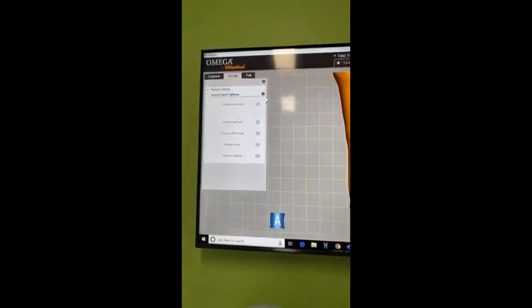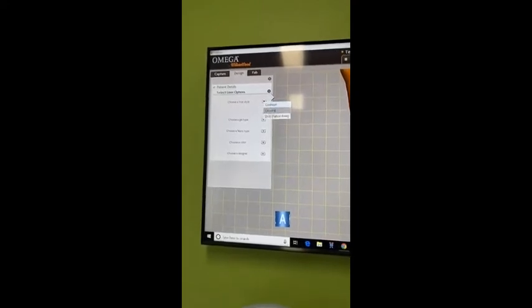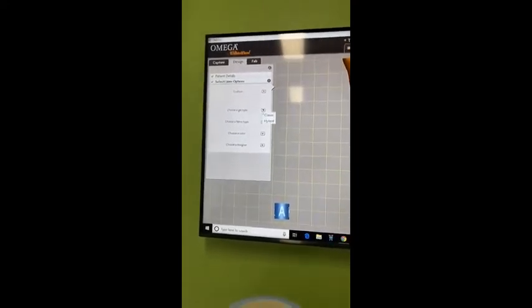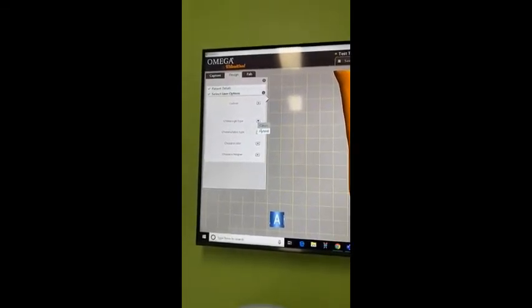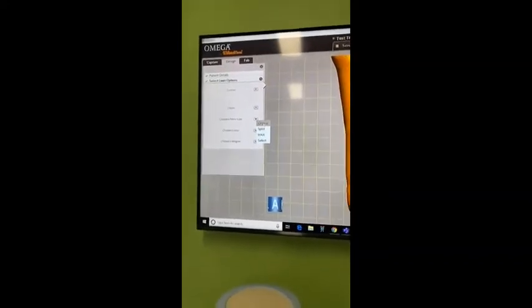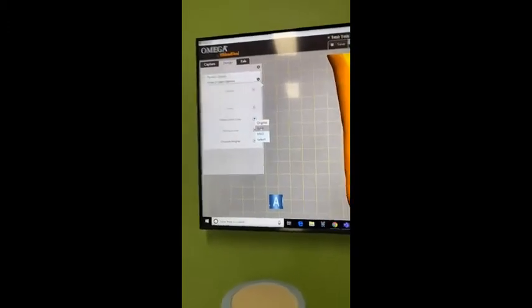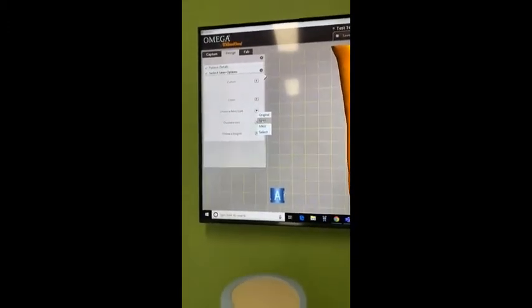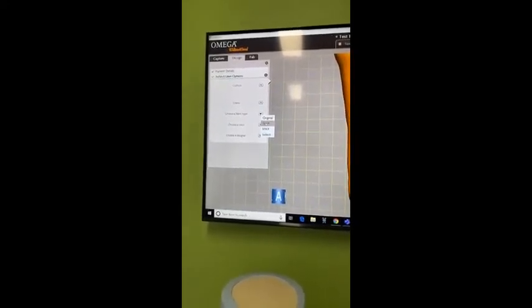Then you can start designing your liner. So we can work out whether it's a cushion, locking, or the duo fabric. You can choose the gel type, which is classic or hybrid gel. We can choose the fabric. So the original fabric is the green-grey fabric that WillowWood liners have started with. The spirit fabric is, call it like it's a furry fronted type fabric.